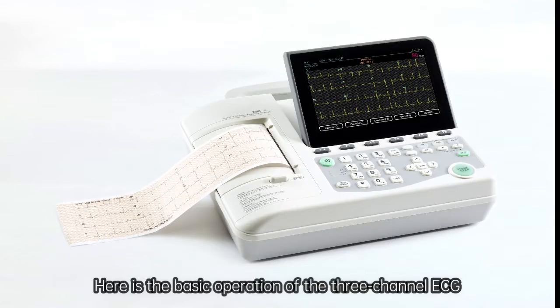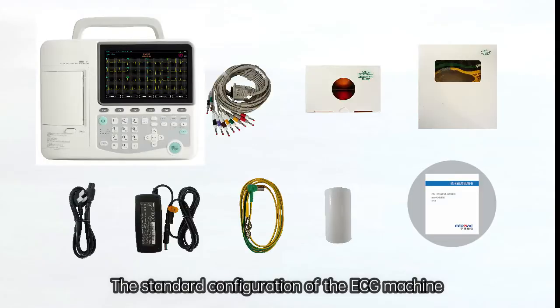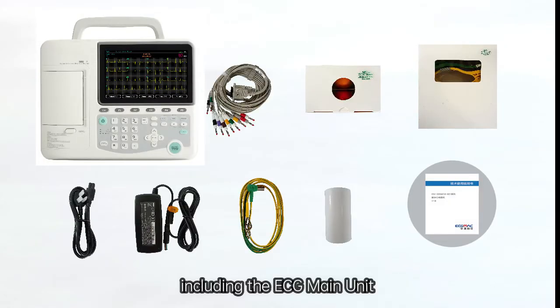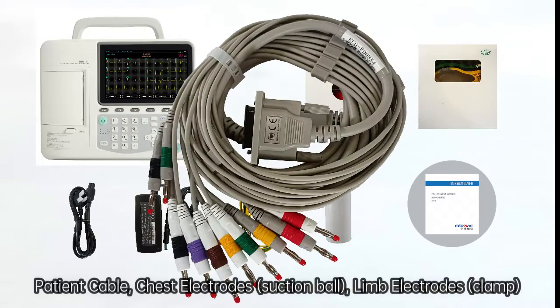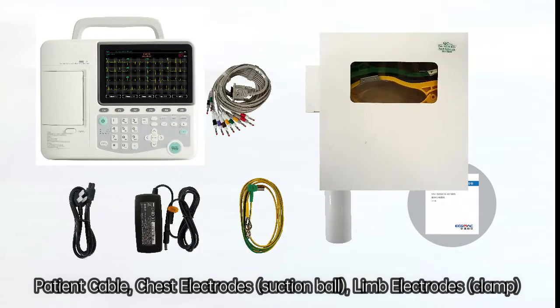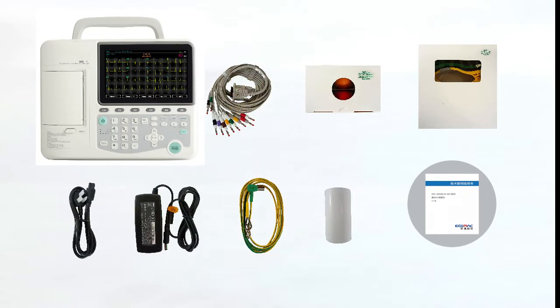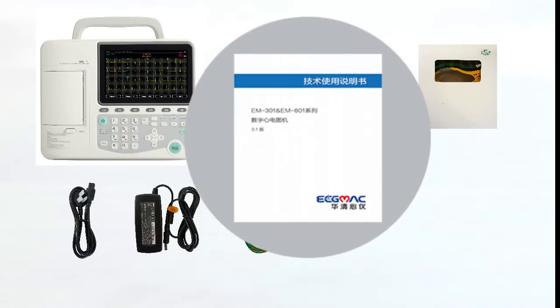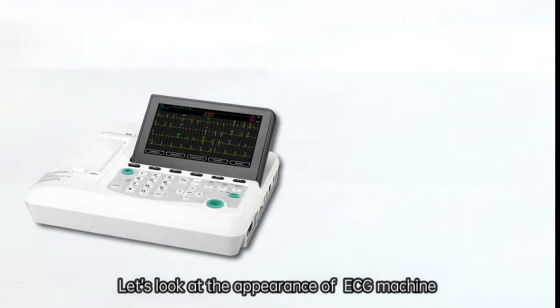Here is the basic operation of a three-channel ECG. The standard configuration of the ECG machine includes the ECG main unit, patient cable, chest electrodes, limb electrodes, power cord, power adapter, grounding wire, thermal roll paper, and user manual. Let's take a look at the appearance of the ECG machine.